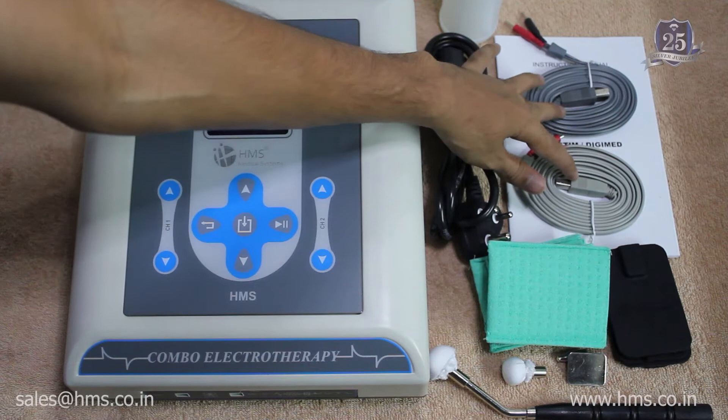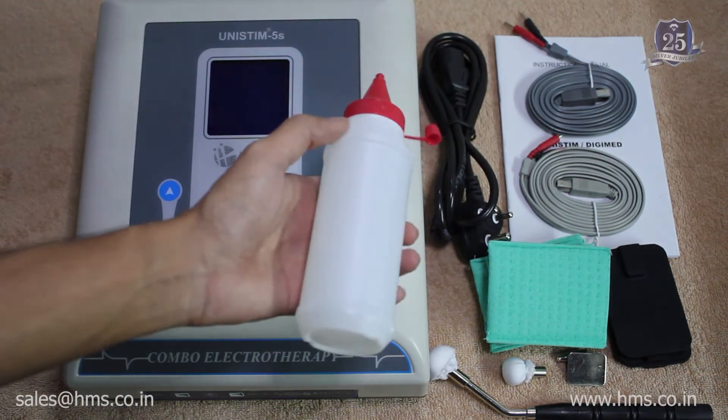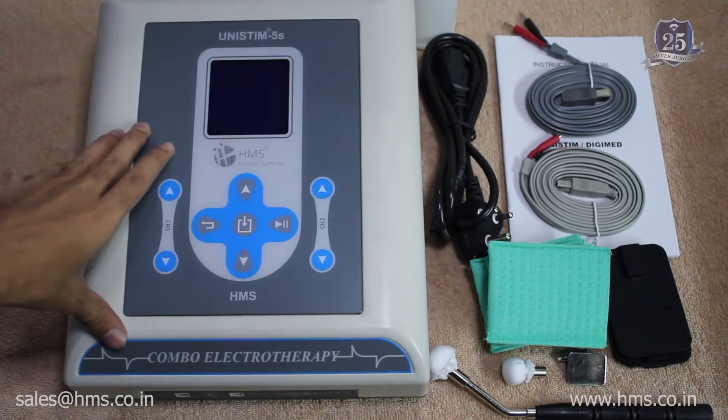These two are the cables to connect the electrodes to the machine, and you also get a user manual and a treatment gel along with the machine. These are the accessories provided with the machine out of the box.